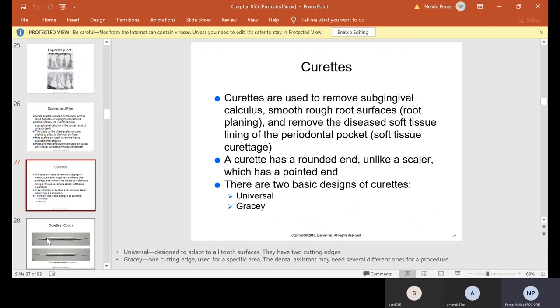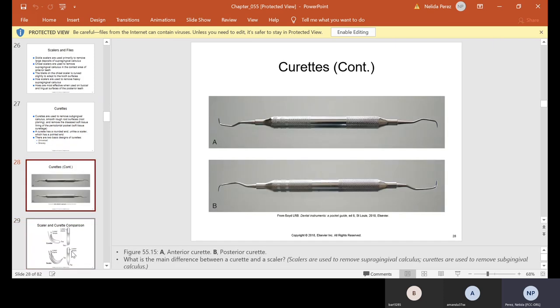Curettes are used to remove subgingival calculus, smooth root surfaces, perform root planing, and remove diseased soft tissue lining of periodontal pockets — soft tissue curettage. A curette has a round end, unlike a scaler which has a pointed end. There are two basic designs: universal, which adapts to all tooth surfaces and has two cutting edges, and the Gracey, which has one cutting edge and is used for a specific area. Letter A curettes are used a lot for the anterior, and letter B for the posterior.